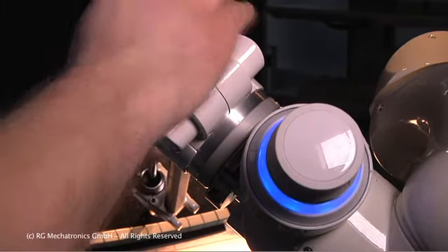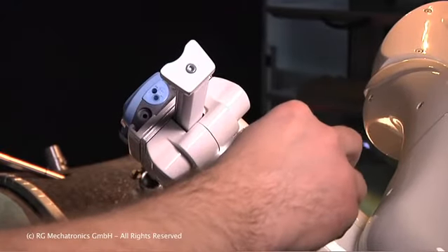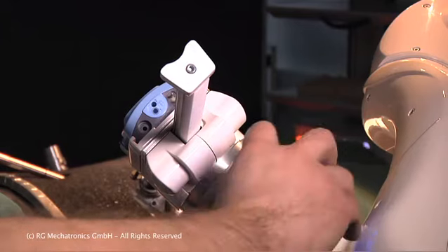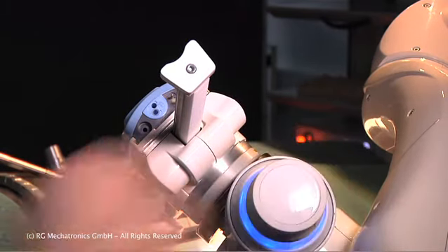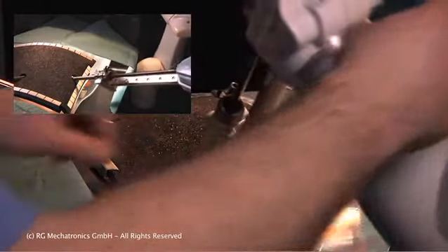And then fixed, so that the tool can now be introduced to the body. It can be driven in and out by pulling on the RoboCommander, and fine adjustment performed by twisting the ring. And now you can see the robot moving around the trocar point, which is fixed.